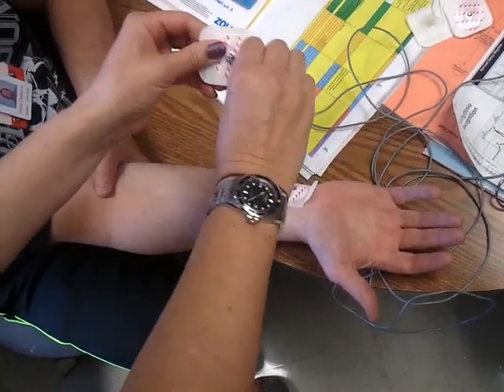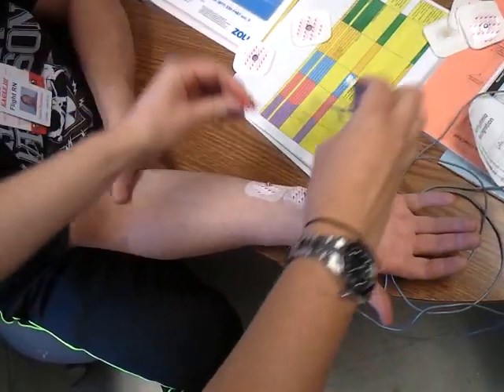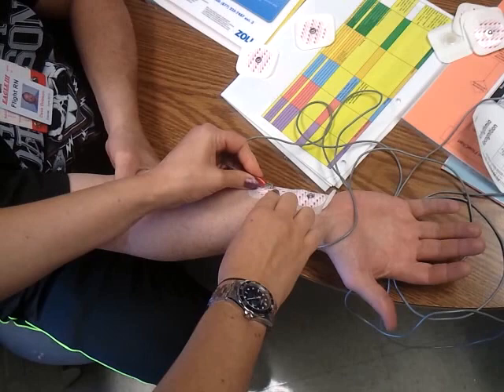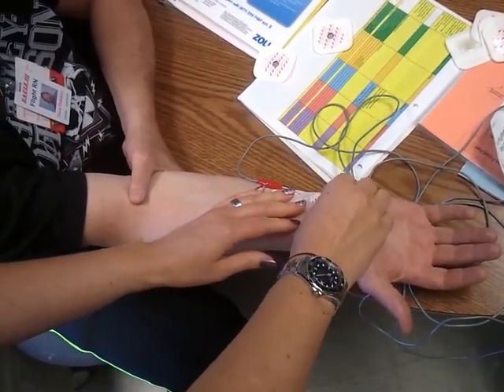And the electrodes. If you can remember, red is closest to the heart. Okay, so red goes here. And then black.